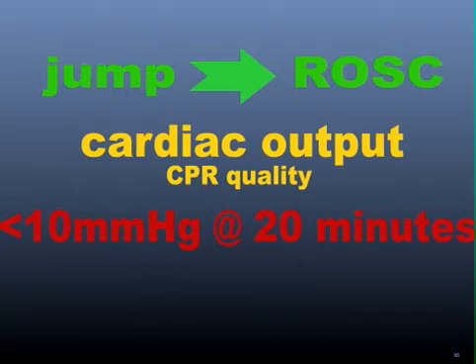Next, as end-tidal is dependent on cardiac output, it becomes a gauge of how effective your compressions are. It's real-time feedback. Plus, it helps you spot when the compressor is tiring out. Lastly, studies have shown that if the value is less than 10, 20 minutes into the arrest, the patient's not going to walk out of the hospital.